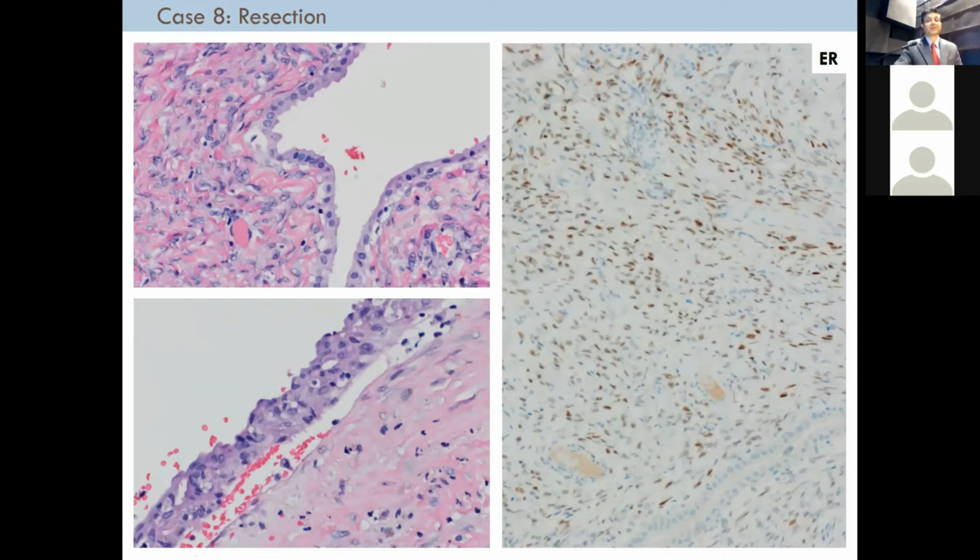There were a few areas that showed the stratified lining, the cells that showed mostly reactive look, and I think this corresponds to the atypical cell groups that we saw on the cytology. No mucinous epithelium was seen in this case. It was entirely sampled. However, we were able to make the diagnosis of mucinous cystic neoplasm in this case by demonstrating estrogen-positive stromal cells. And this was a very unusual case where no mucinous epithelium was seen, but these cases have been reported.